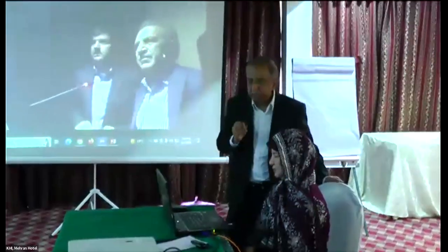जी चले, जुनैद से एक सवाल ले लेते हैं जी, प्लीज। Thank you very much. Nicely presented. Here's just a quick confusion. Confusion is that in setting of an aortic pseudoaneurysm, would you go for invasive angiogram, or should you have proceeded for fixing the problem with an invasive angiogram, or opting for some other modality? You know, if there is an aortic dissection and you have a pseudoaneurysm, they are going through the aorta for angiogram, would that not be too invasive or aggressive?